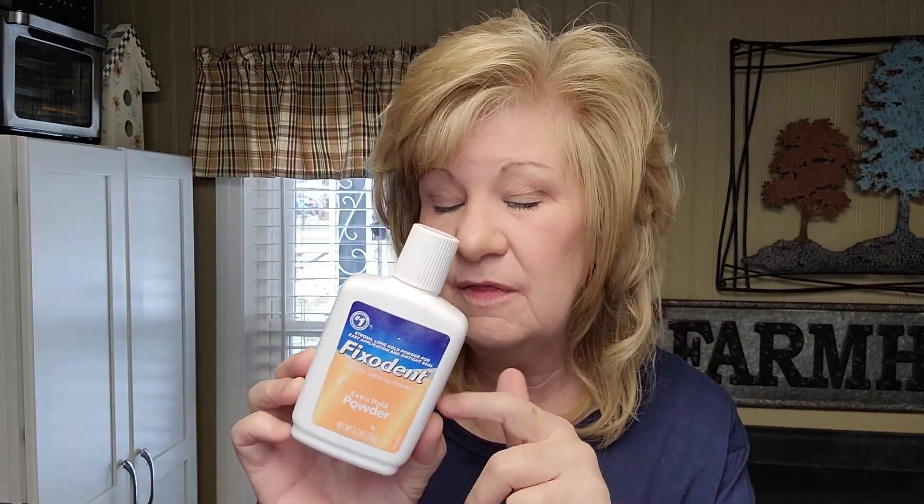Those are my top eight denture adhesives and why I like or don't like each one. Also, keep this powder on hand — you can add it to any denture adhesive, powder or cream. It really helps with the hold. Sometimes I even put some paste in my upper and then some of this powder and spread it out with a toothpick, and it works great.